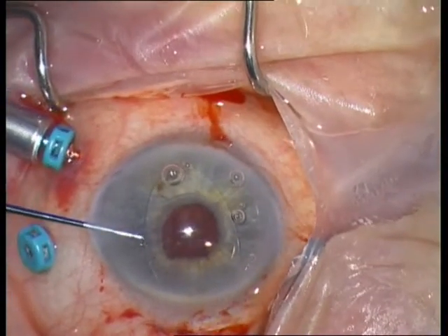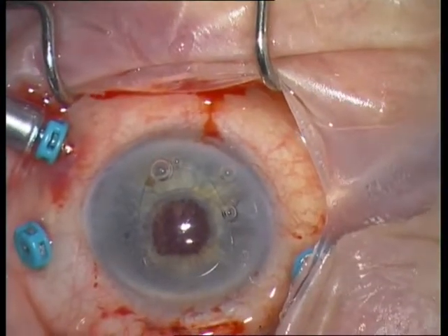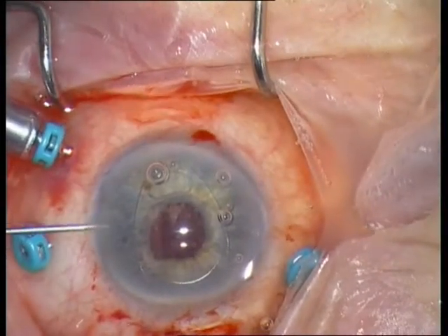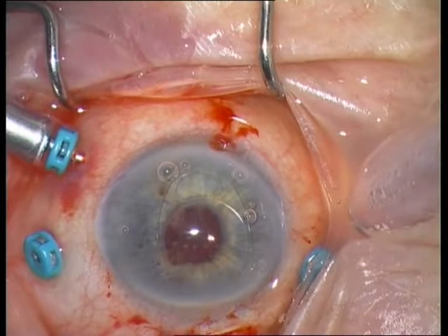This is a rotator that comes with the AMO instrument set. You can also use the iris spatula, but it is easier with the rotator.